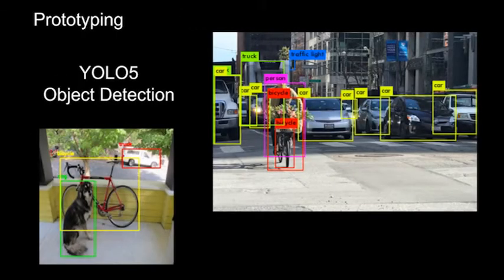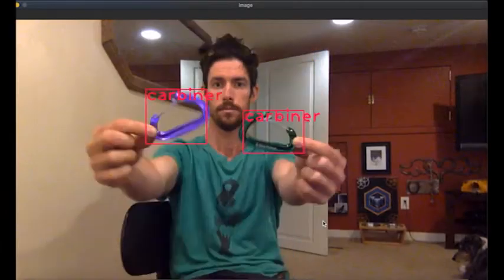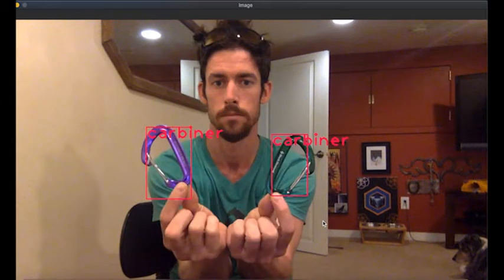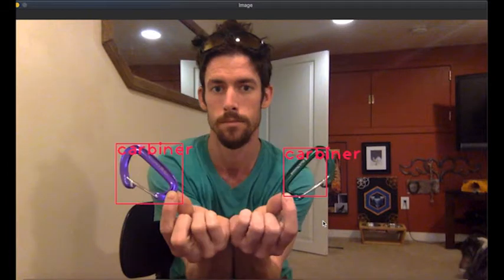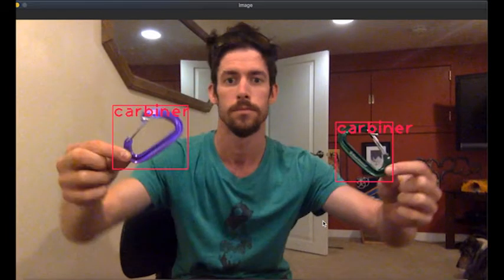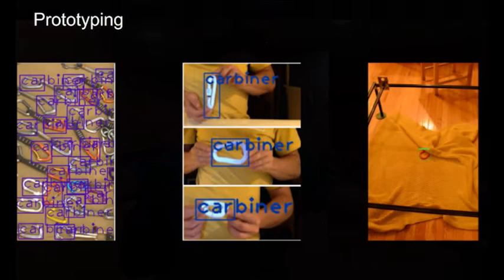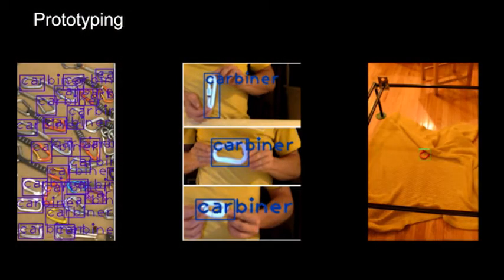Object detection is provided by an open software program named YOLO5. The chosen object to be the target patient lift point is a generic climbing carabiner. Multiple photos of the target were created in an image library which the software, through machine learning, develops the ability to detect the target from an input image and outputs the target's pixel coordinates. The carabiner went through design changes involving its color, finalizing on a red paint.